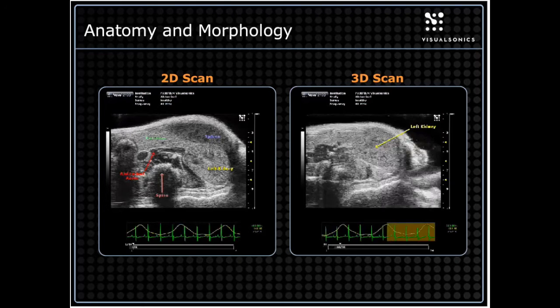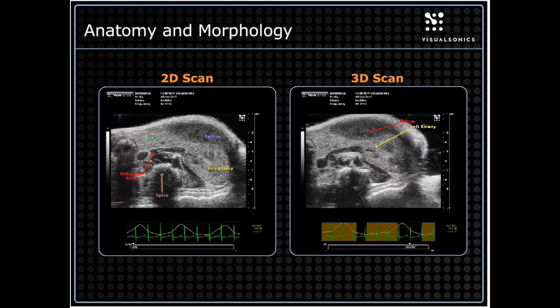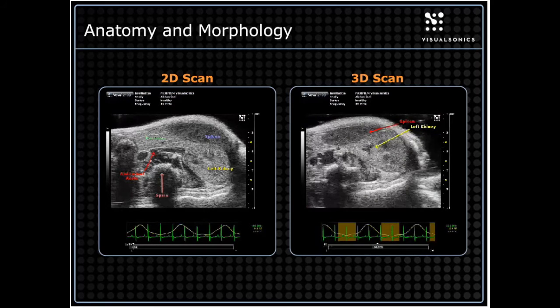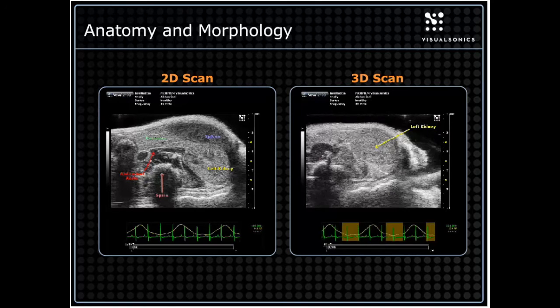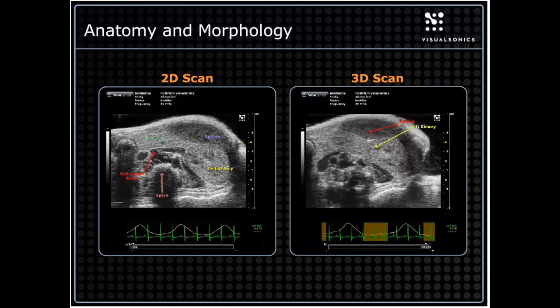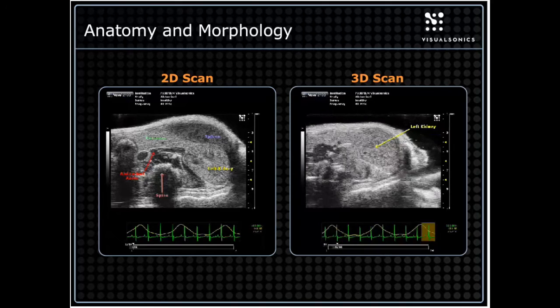Just in the 2-dimension section, together on the ultrasound, you can link this with a 3D motor to do a 3D scan across the abdomen, as you can see now in this movie, and you get information on tumor volumes, for example. What hasn't been mentioned so far is that physiologic monitoring, animal physiology, is important in imaging if you look at functional parameters. And at the bottom of this 3D scan, you do see respiration and ECG displayed, and also a gating for respiration for doing a 3D scan on the ultrasound.